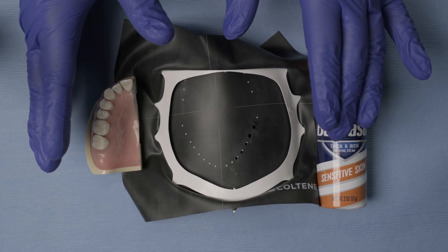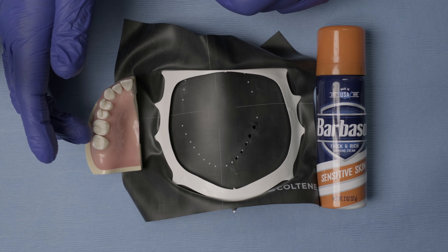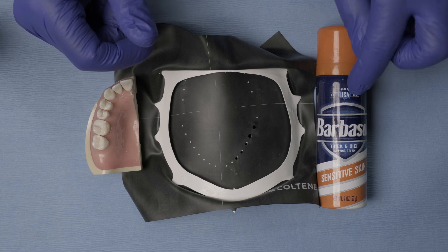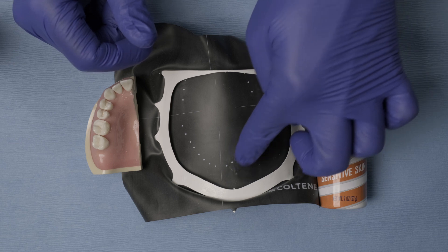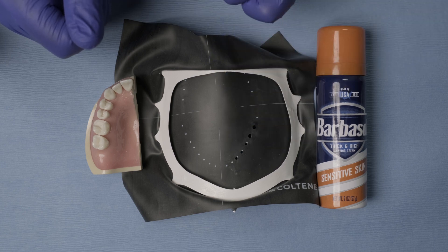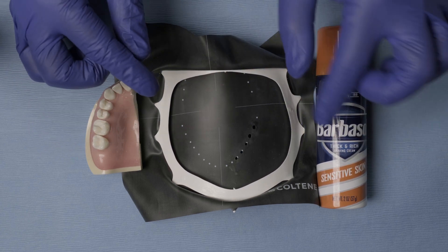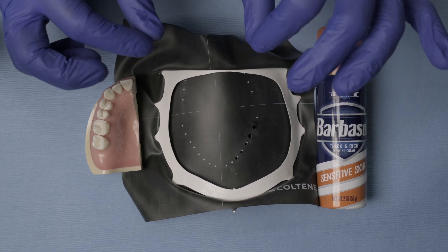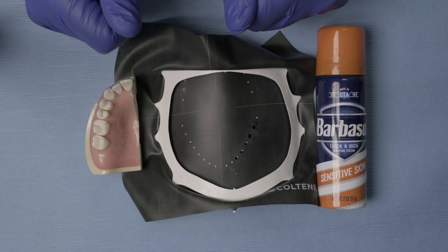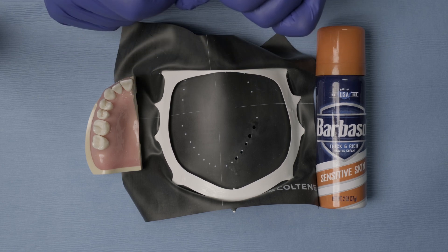A common issue is when patients have really tight interproximal contacts — it's hard to push the septa between the perforations through that contact. The solution I've found is shaving cream. By adding a little bit of shaving cream to the perforations, it makes it a lot easier to go through each interproximal contact when placing the rubber dam. You can use this for any type of rubber dam, but I highly recommend it especially with latex rubber dam, since it's more resistant and creates more retraction, making tight contacts more difficult to get through.